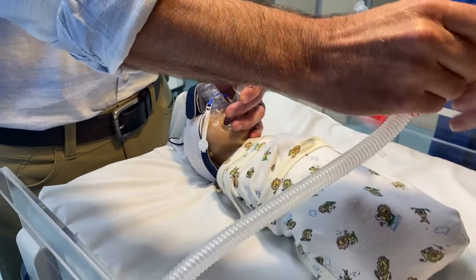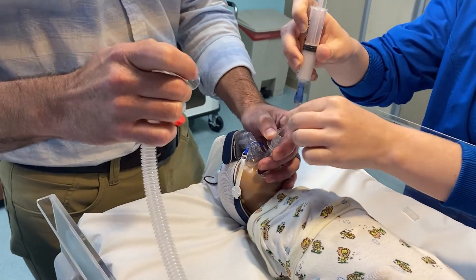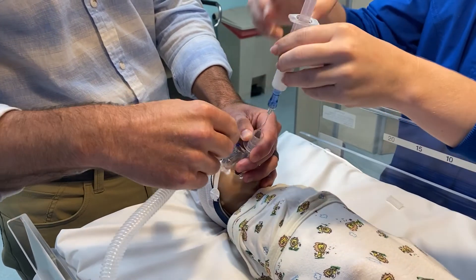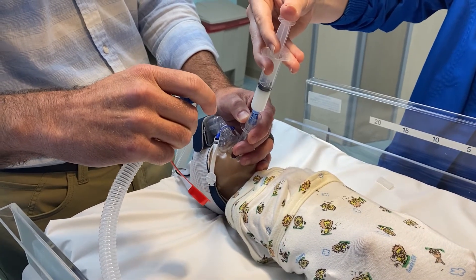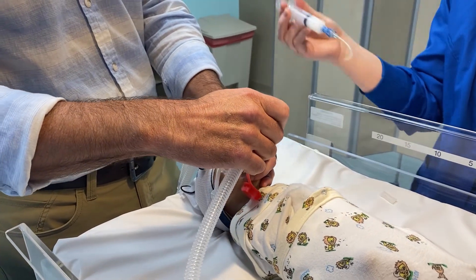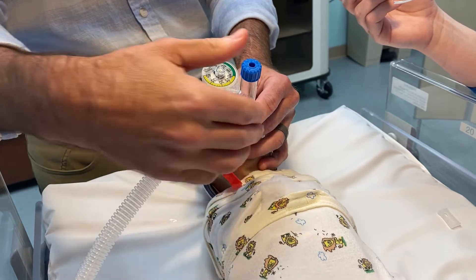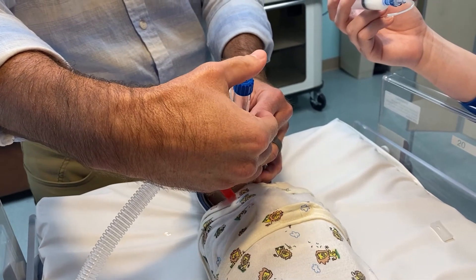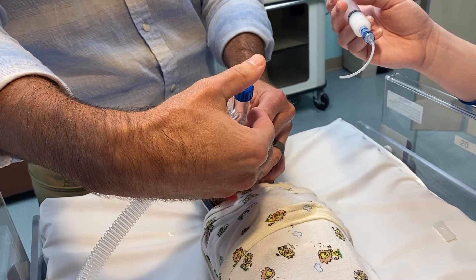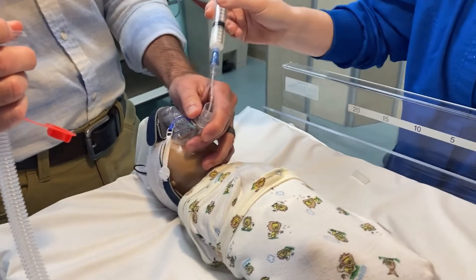Begin by giving one to two milliliters of the surfactant. This device itself will hold about two milliliters. You may see it fill up — remove the tubing and then place pressure back on. Right now we're just giving PEEP, and that may work to push the surfactant down into the lungs. You may need to give a couple of breaths. Make sure the surfactant has cleared the device, then give another two milliliters of surfactant.